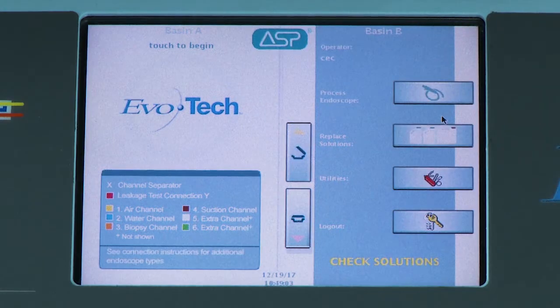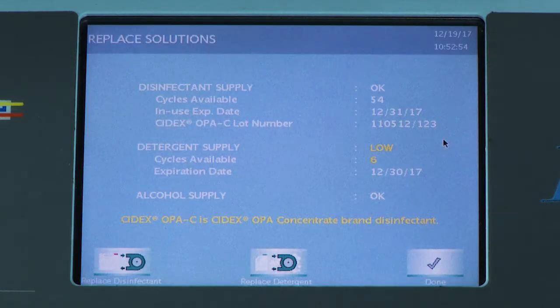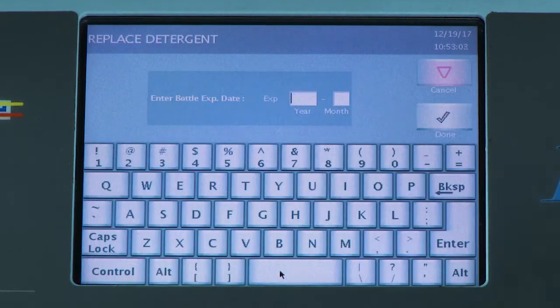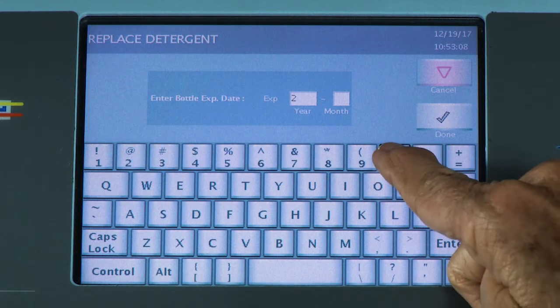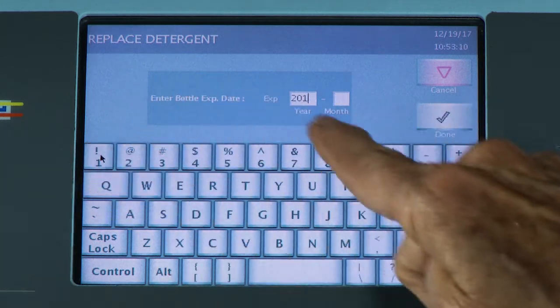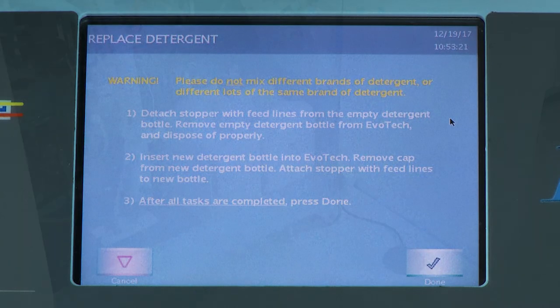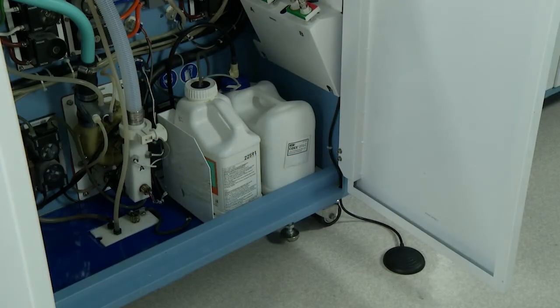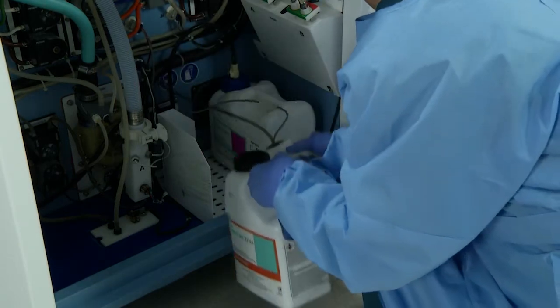To replace Cytozyme Extra Multi-Enzymatic Detergent Solution, touch the button on the display screen that shows 3 bottles and states Replace Solutions. At the bottom of the screen, select the button Replace Detergent. From the new bottle of detergent, enter the expiration date into the expiration date field. Then hit Done. Open the cabinet door and remove the lid from the Cytozyme Extra bottle and transfer it onto the new bottle of Cytozyme Extra.